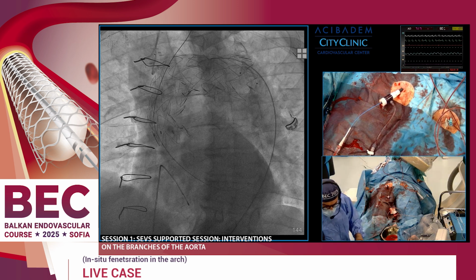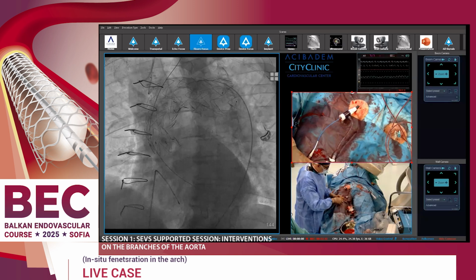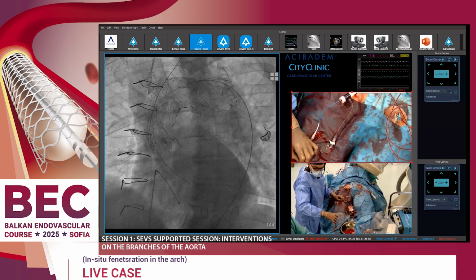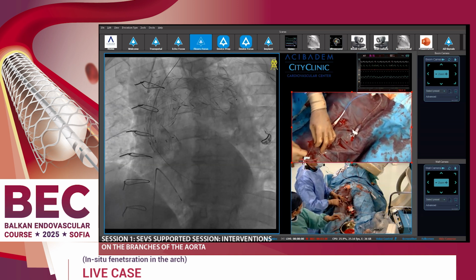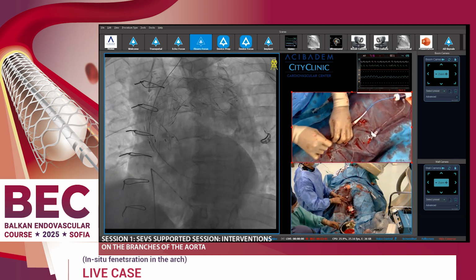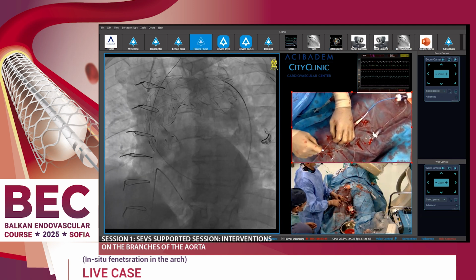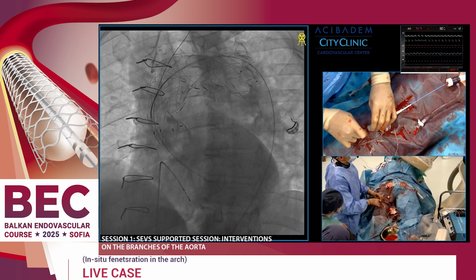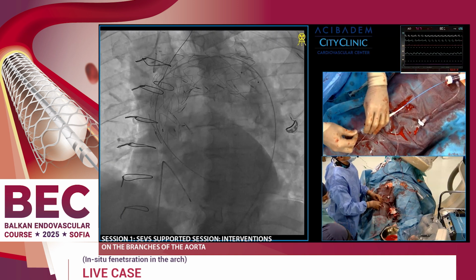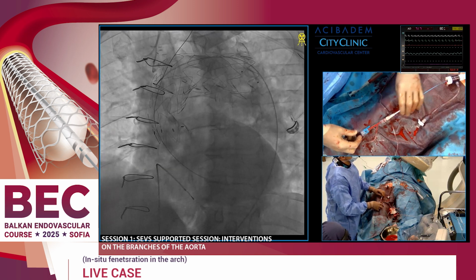Okay, excellent. Okay, I will put. Good, you probably see. Now this is the lasso coming. The lasso coming. And now it's more or less in a good position.